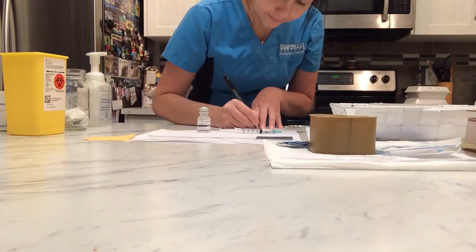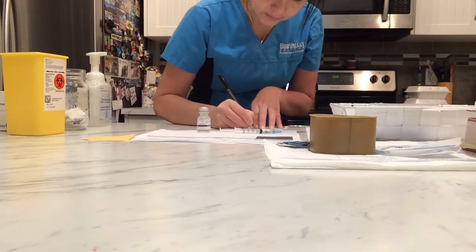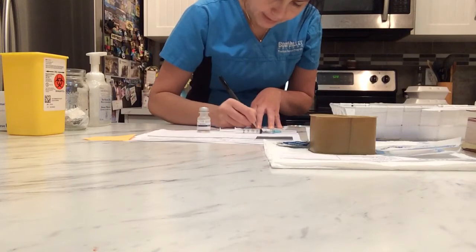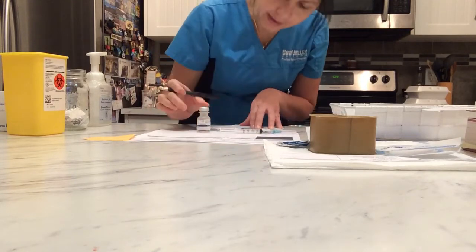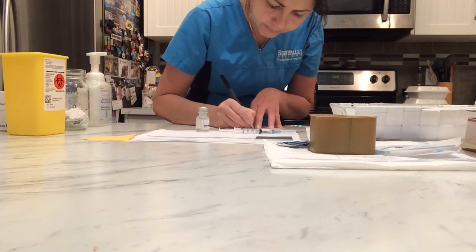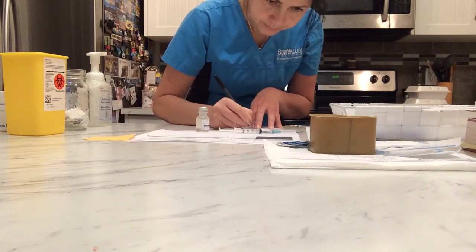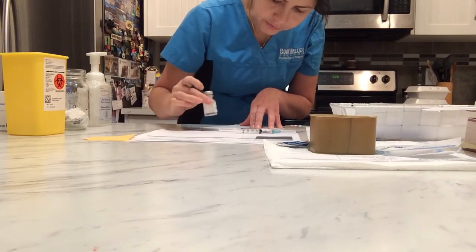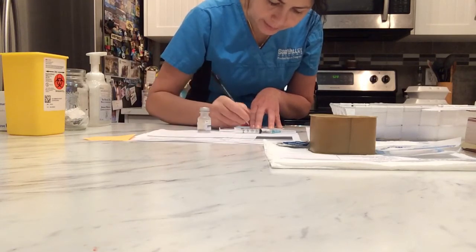Today's date November 30, 2020. It is 12 o'clock, and the medication is Ketorolac. The concentration is 30 milligrams equals 1 ml.